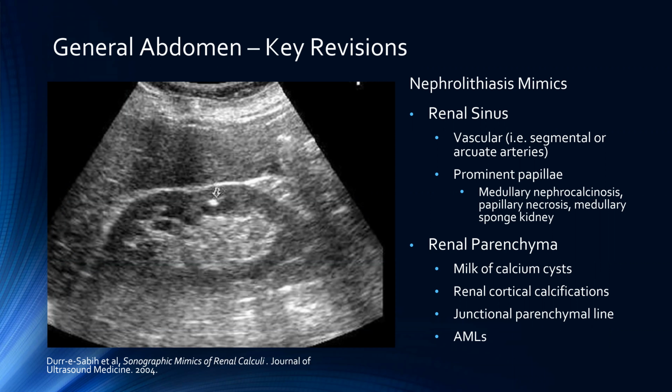Not uncommon that we'll call something a renal calculus on ultrasound, and the patient will go on to subsequent contemporaneous CT, or alternatively will have already had a recent prior CT with no correlate for the described stone. And this is just part and parcel of ultrasound of echogenic lesions within the kidneys. We're never going to be able to be 100% accurate with these, and it can be really difficult or impossible to differentiate renal calculi, particularly small ones, from some of these entities. But optimizing your technical parameters does give you the best chance of doing so.